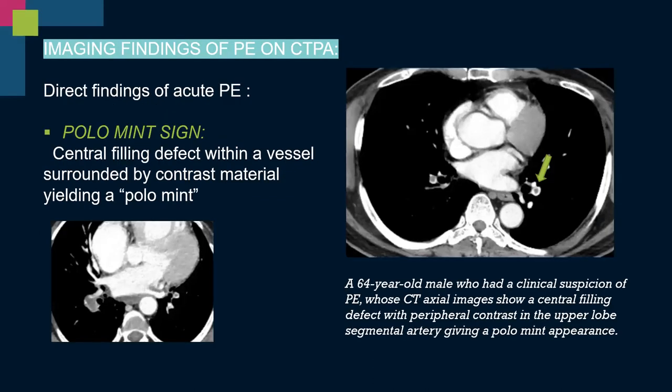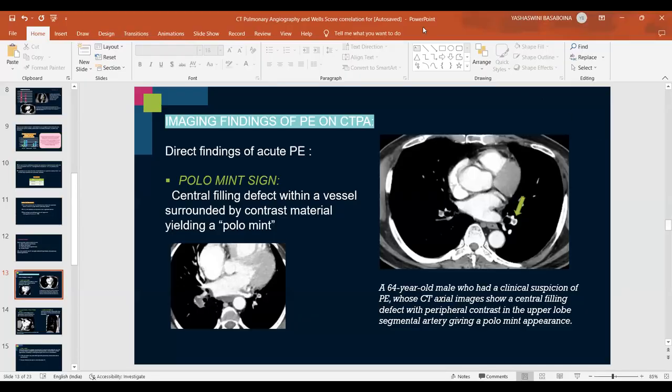Coming to the imaging findings of pulmonary embolism on CTPA, one sign observed was the polo mint sign — a central filling defect with peripheral contrast yielding a polo mint appearance. These images show the polo mint sign. A 64-year-old male with clinical suspicion of pulmonary embolism had CT axial images showing a central filling defect with peripheral contrast in the upper lobe segmental artery, giving the polo mint appearance.